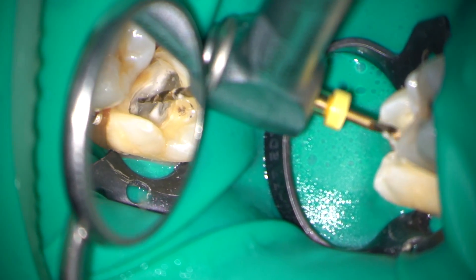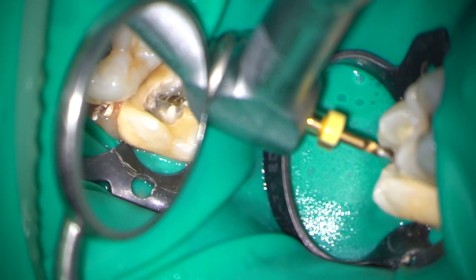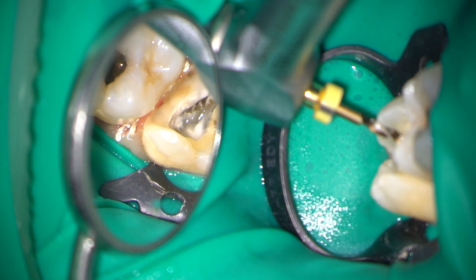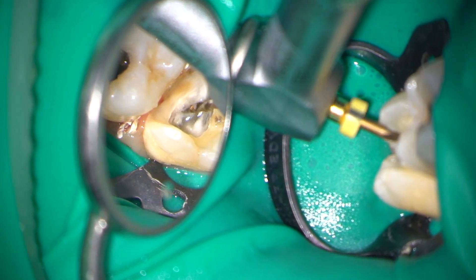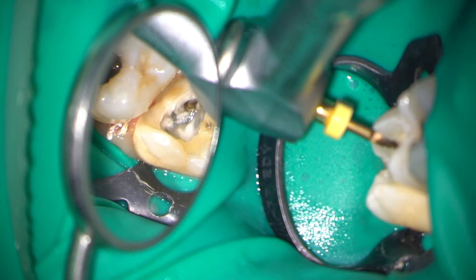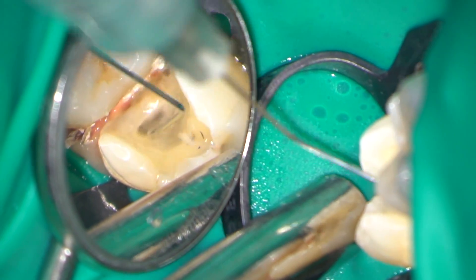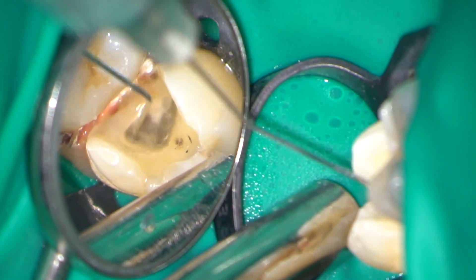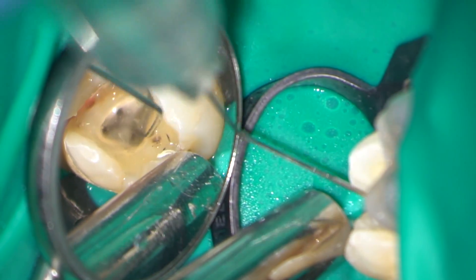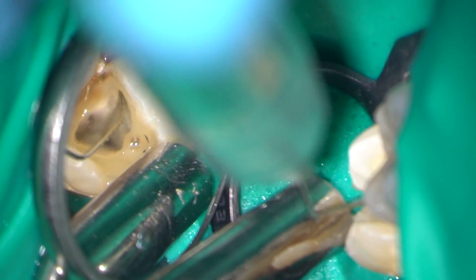You can see that I'm using this instrument with a light brushing action into the bulkiest part of the root. It's important to flush away any debris with hypochlorite solution and use a patency file just to check that you're not blocking the canals.